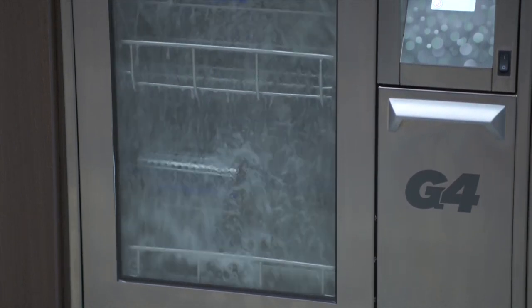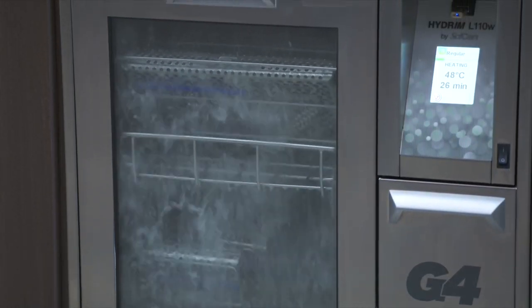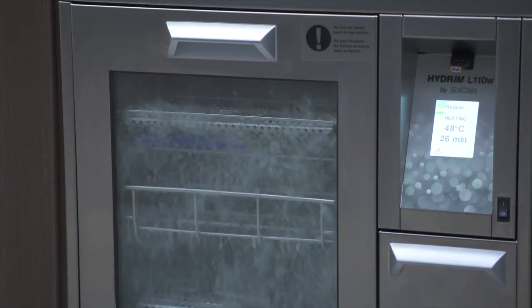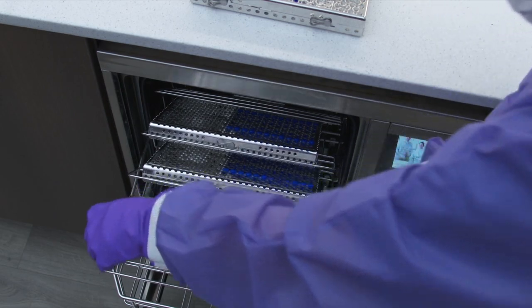Every set of instruments receives the same validated cleaning process with each cycle by dosing the correct amount of detergent. This allows instruments to immediately be transferred to the next step of instrument reprocessing: sterilization.